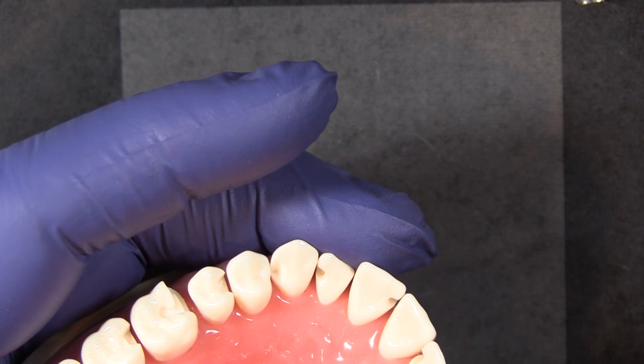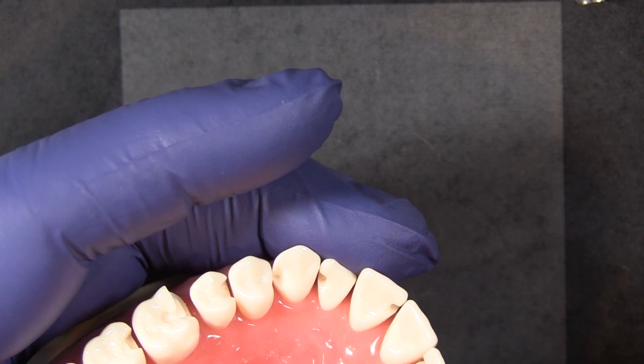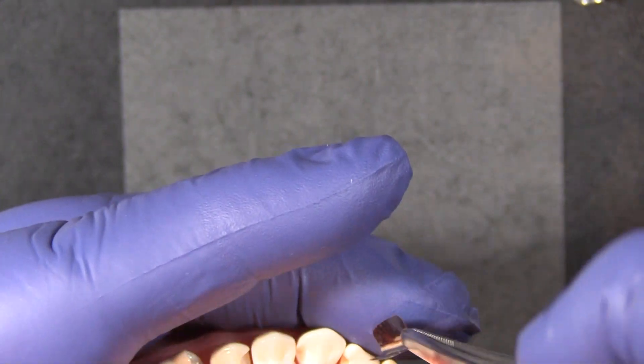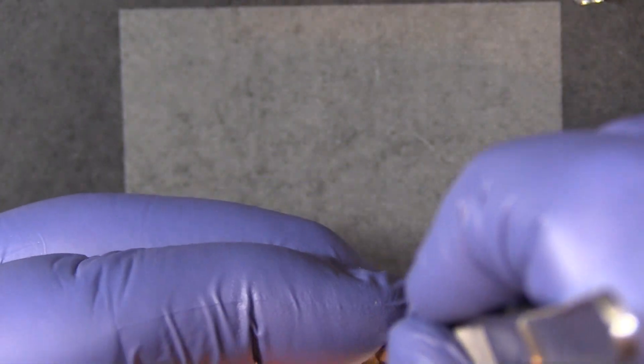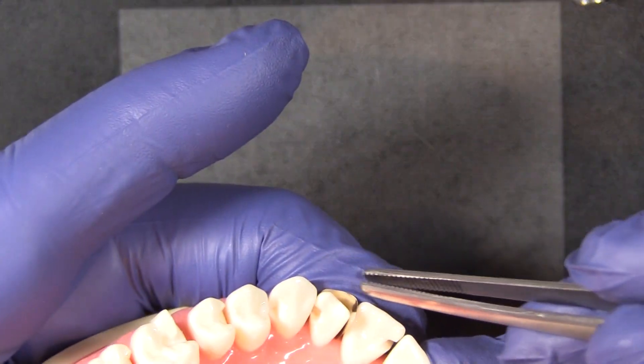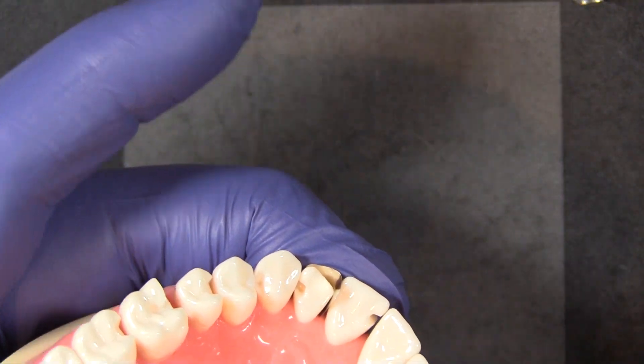Now on a Class 4, number 7 is a little shorter tooth, so I wanted to grab the shorter band. In this case, I'm going to place it so that the wide part of the band is towards the incisal edge so that I can cover all the way across where I need to restore that.